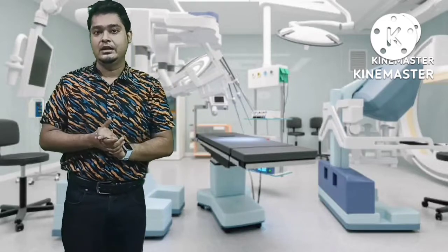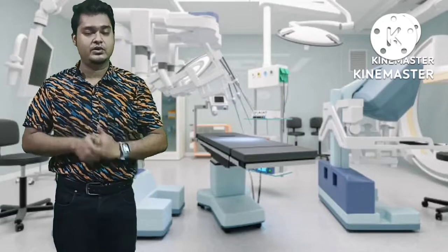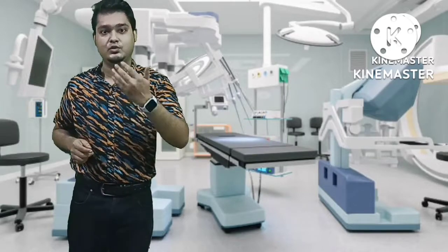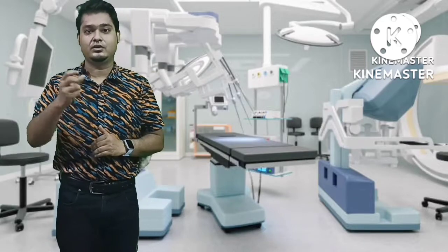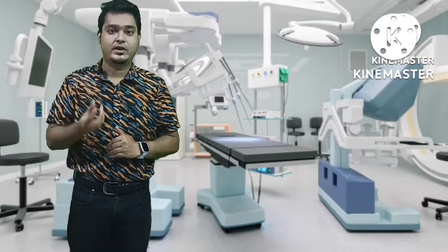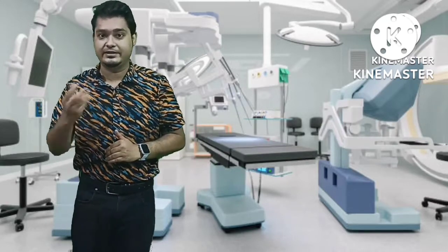But if the heart blockage is not confirmed and we want to know whether the patient is having a heart blockage or not, in that condition the patient can go for a CT coronary angiography. So CT coronary angiography is a good examining tool to detect the blockage, detect the percentage of blockage, or to clear our query whether the patient is having a blockage or not. But it is not a good option for the treatment.